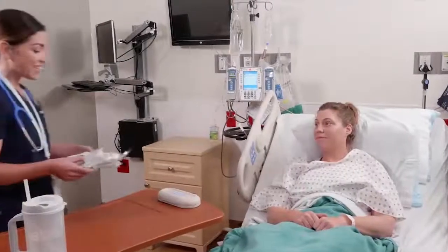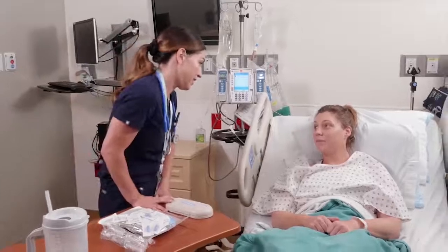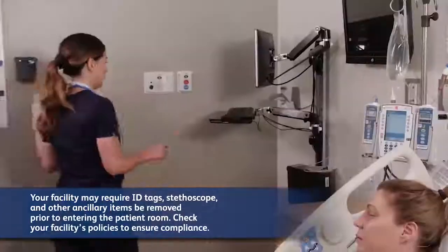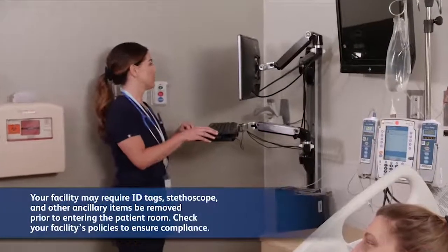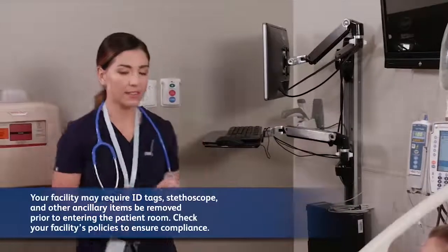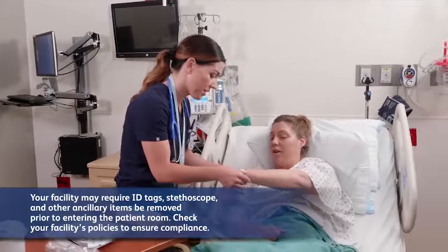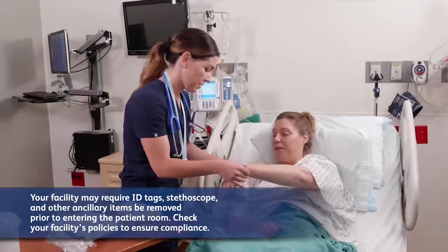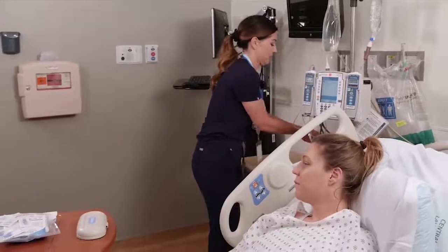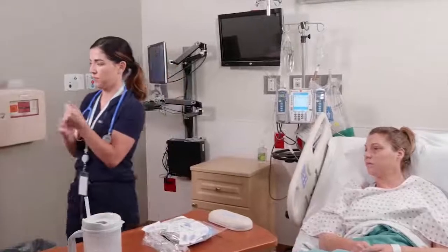To begin the sterile dressing change procedure, first, start by reviewing your institution's policy and procedure. Then, verify the patient's identity with two independent identifiers, such as having the patient state her name and confirming to the medical bracelet. Perform hand hygiene with an antimicrobial hand scrub or hand washing, assuring hands are allowed to completely dry.